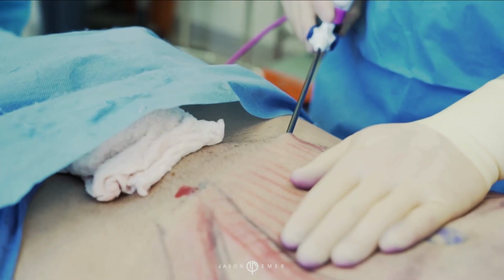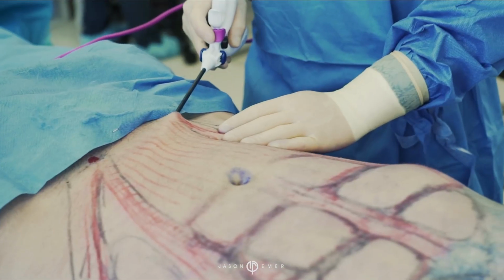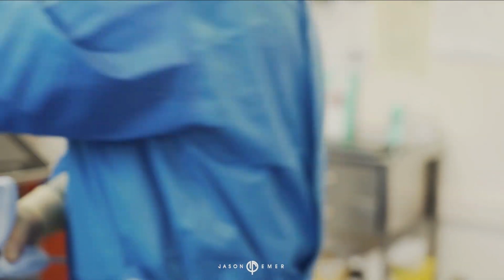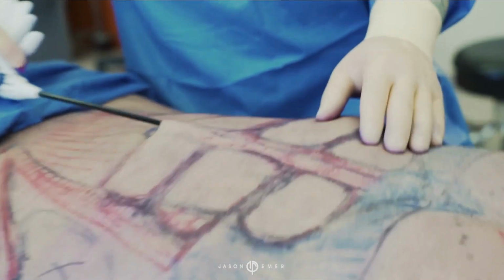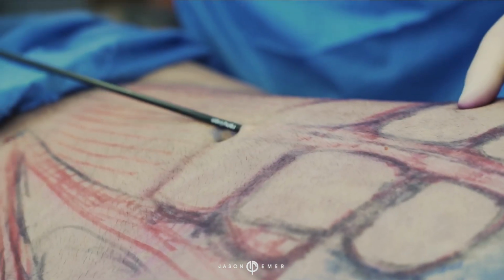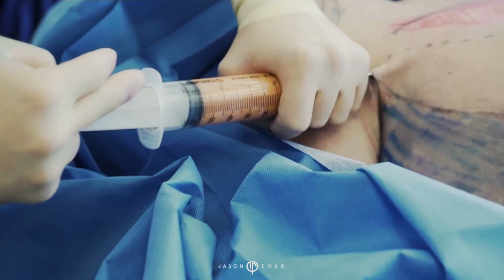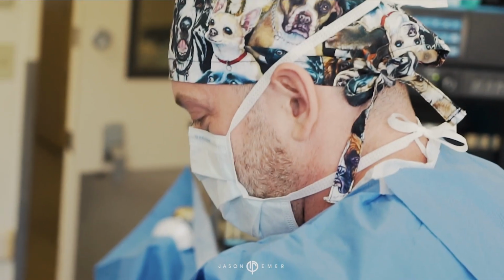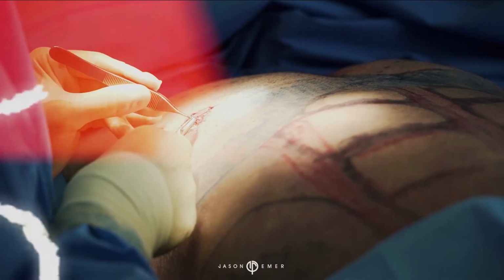Now we're doing Renuvion on the lower stomach. This is the internal heating portion. So that's going to be tightening the skin underneath. One of the great areas is this midline area. He really wants that upper chest defined, so we're going to build it out a little bit. And it doesn't look like it, but we've done a lot.